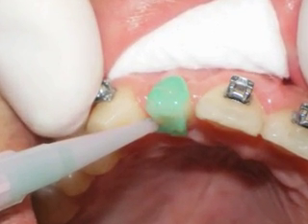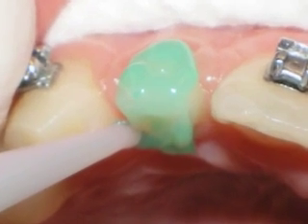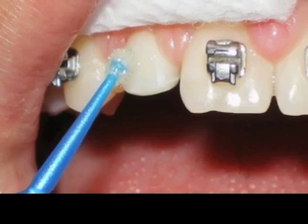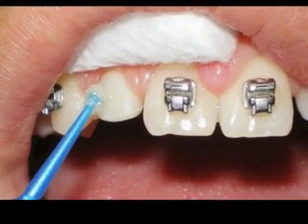I then use a gel-type etchant to thoroughly etch the entire target tooth, making sure to get the mesial and distal contacts. I rinse off the gel, dry thoroughly, apply sealant, and cure for 10 seconds.